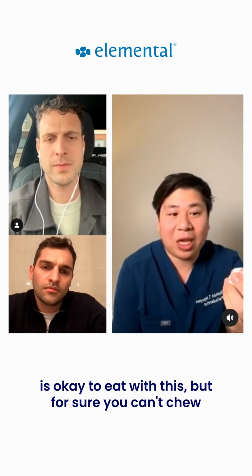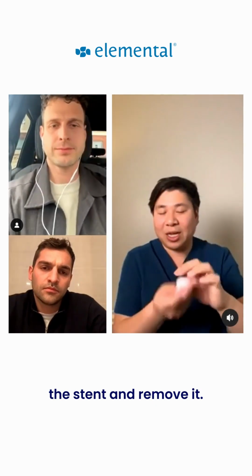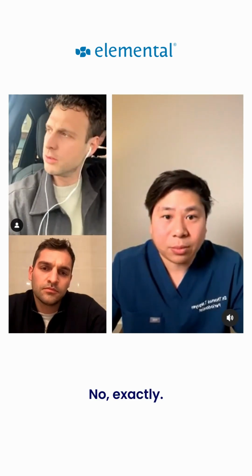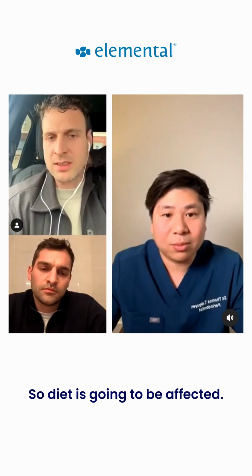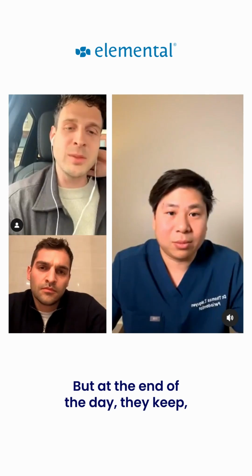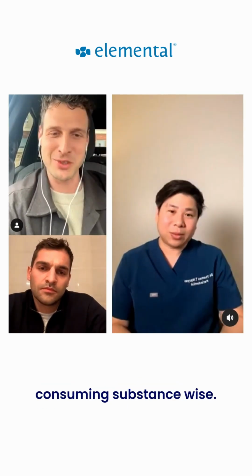But for sure, you can't chew on something harder because it may unbalance the stent and remove it. Exactly. I think diet is affected regardless, right? Because we've got sutures in the recipient side nonetheless. So diet is going to be affected. But at the end of the day, they keep it while they are eating or whatever they are consuming, substance-wise, afterwards.